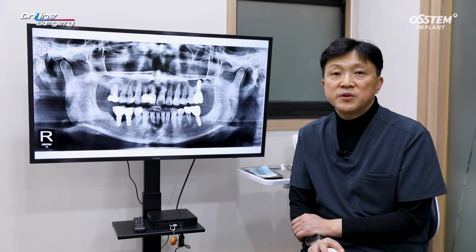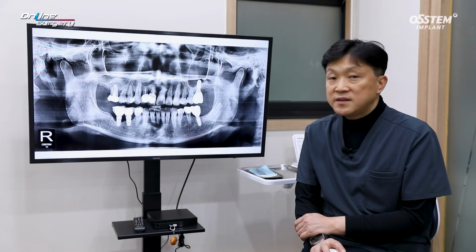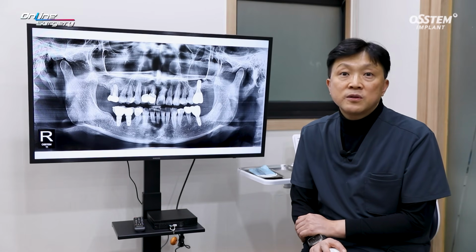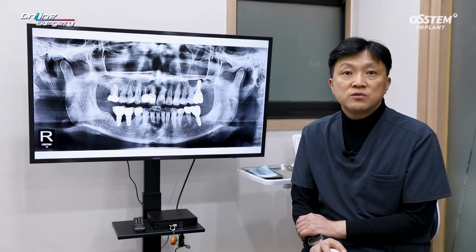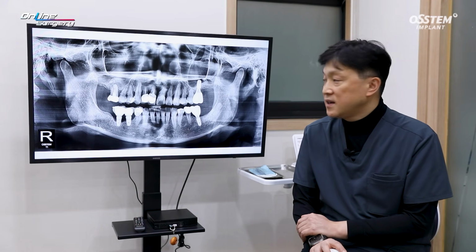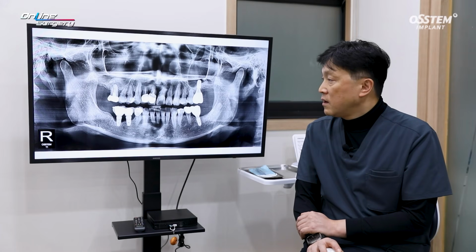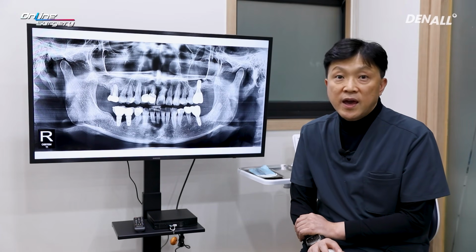Restorative treatment is actually impossible for this type of patient, leaving us with only the time-consuming option of removing the problematic implant and replacing it with another one and restoring hard tissues through bone grafting and GBR. So for this patient, I plan to use OneGuide to remove and replace the implant.